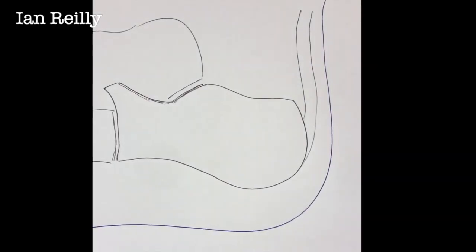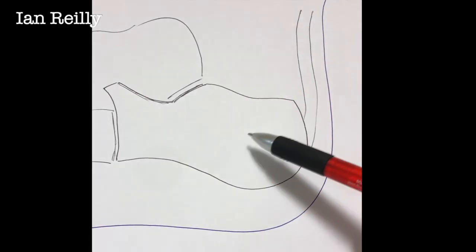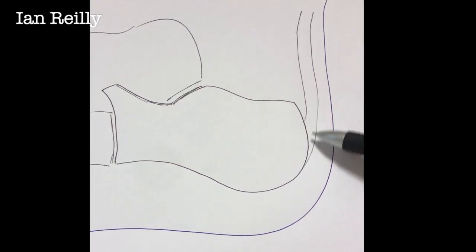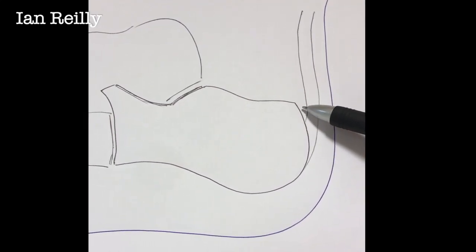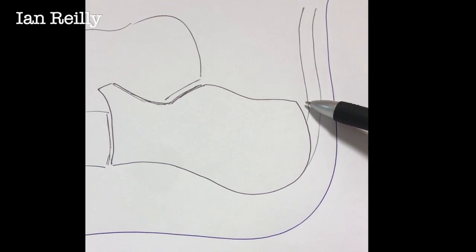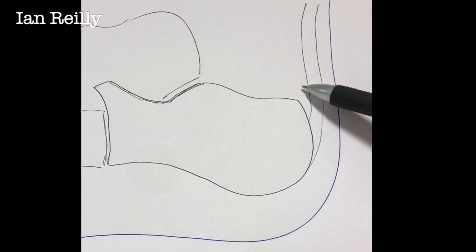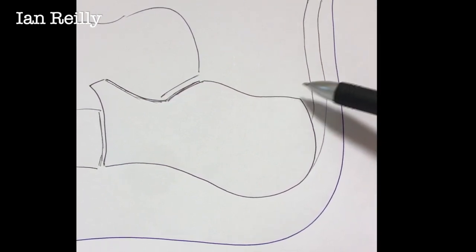A quick schematic then at the back of the heel. Obviously we've got the calcaneus here, so the Achilles inserts really quite low down on the calc. And this is where the pre-Achilles bursa sits here — normally very small, but as you see on the MRI just before, the whole thing gets really quite enlarged and swollen.